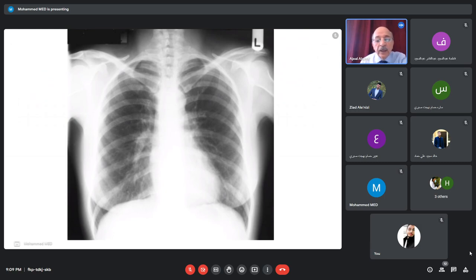This slide shows a normal chest X-ray as a matter of fact. I have given you the two conditions to read the chest X-ray, and I'll say it again. First of all, positioning. Second, exposure. And this is a female, so please pay attention to the breast shadow. Do you see the breast shadows here on both sides, the right and the left? I'm sorry that you don't see the pointer. Otherwise, you would have seen clearly, particularly the lower border of the breast. Sometimes this is confused. That's why on reading a chest X-ray, you should know whether the patient is a male or a female, and please don't confuse the breast shadow for an abnormality. Next slide, please.